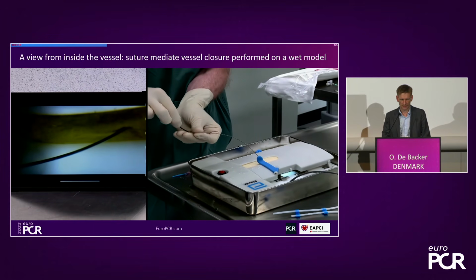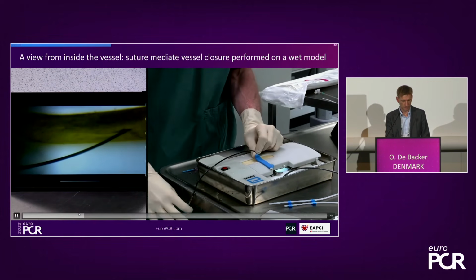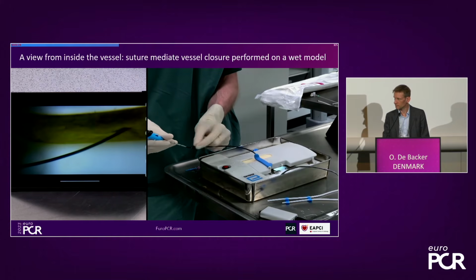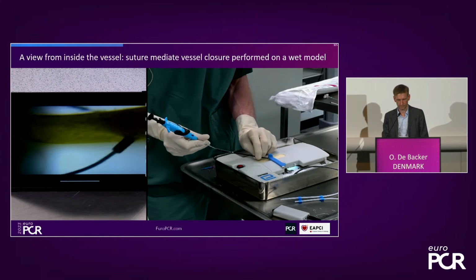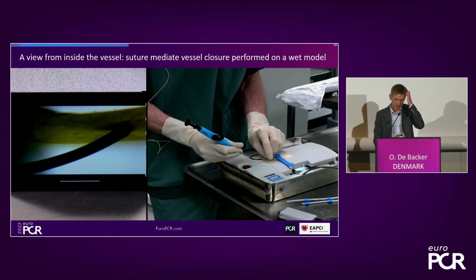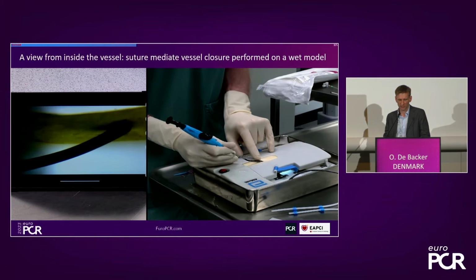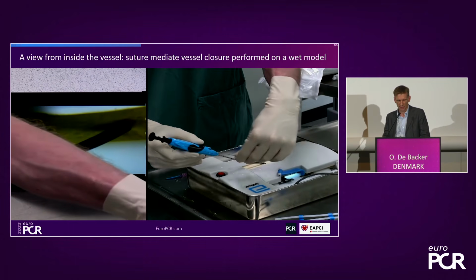So why do we see this? Because I think these are very commonly seen. We need to focus on the 45 degrees afterwards. ProGlide, ProStyle. Did you see any difference? When they came to me, it looked the same with a different color, but actually it works better. So why do you think it works better? Well, what I know is that the needles are a little bit stronger. So you have less deviation of the needle. If there's a small, tiny spot of calcium, then it's more rigid.